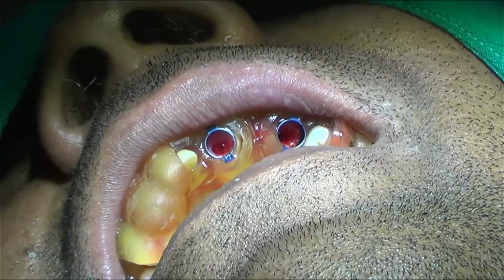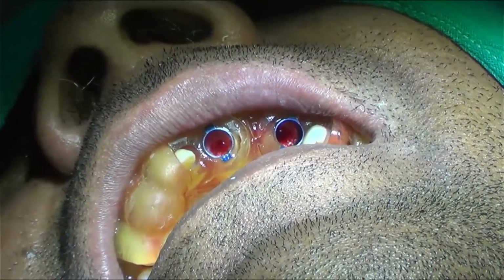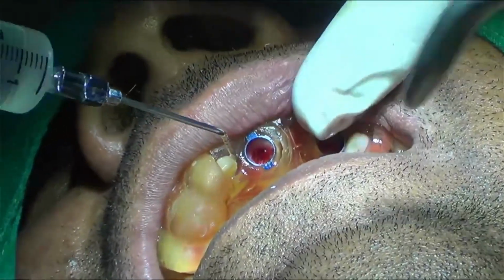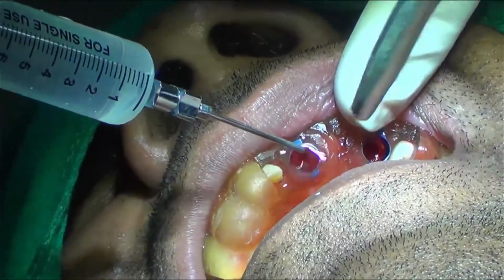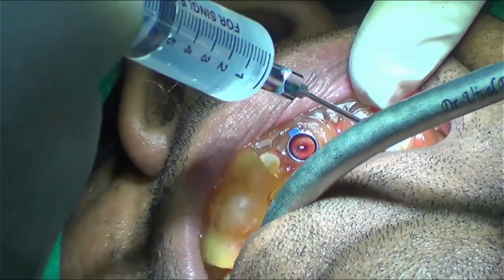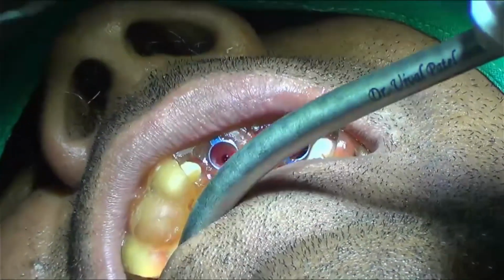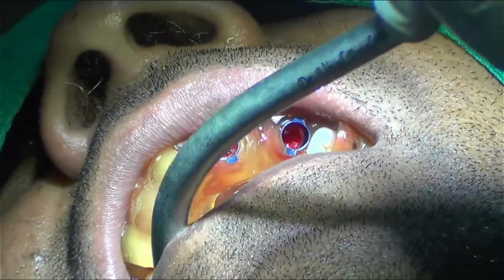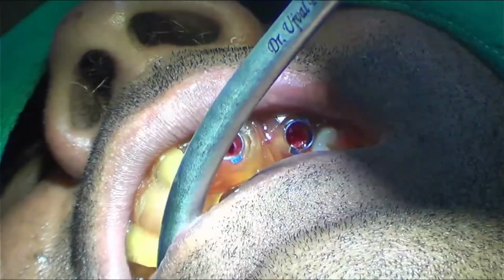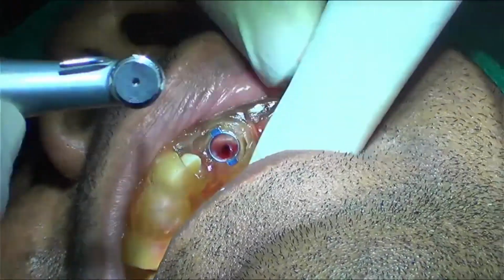So you can see in this much time the blood will not, the bone will not heal. So you see how irrigation I am doing, a proper irrigation. This much of irrigation won't even reach the osteotomy with even your normal irrigation. So next is 2.7 into 13.